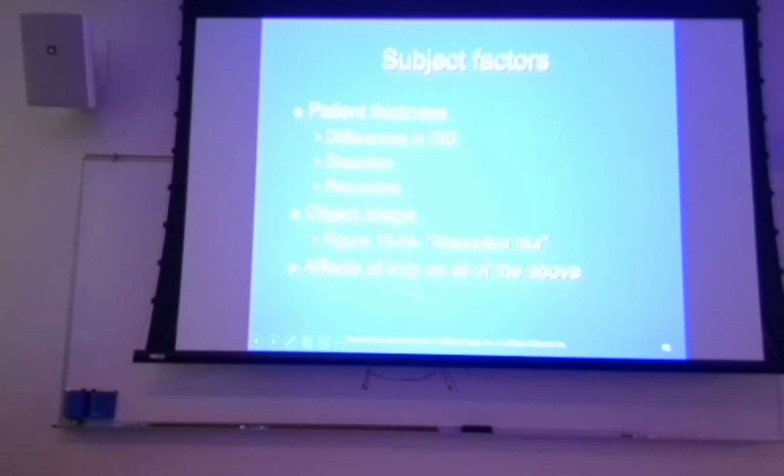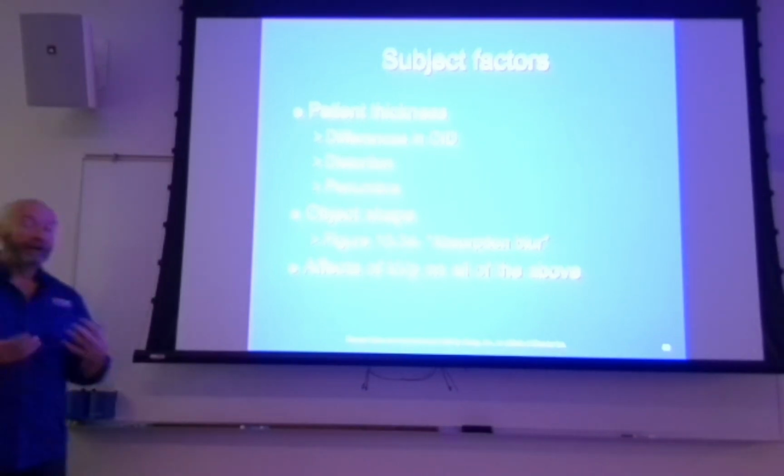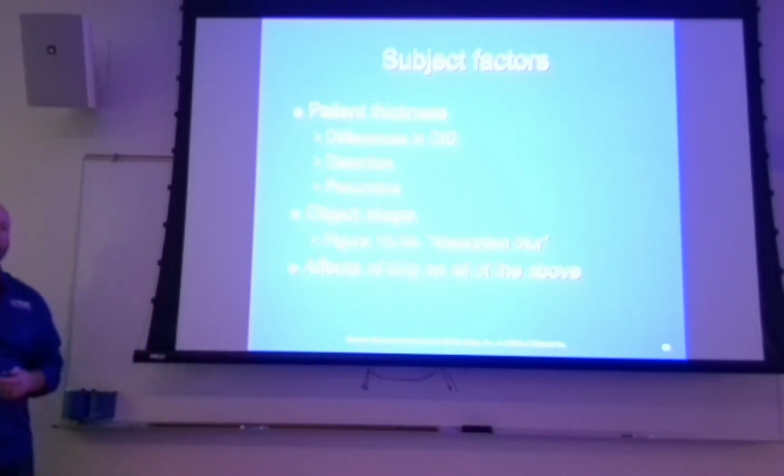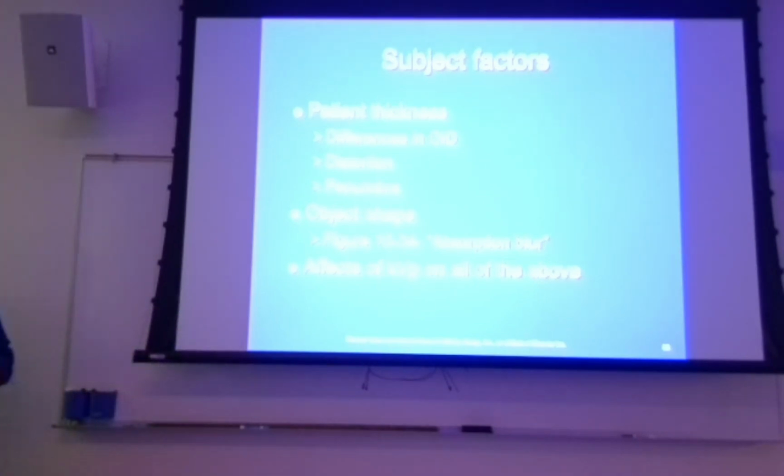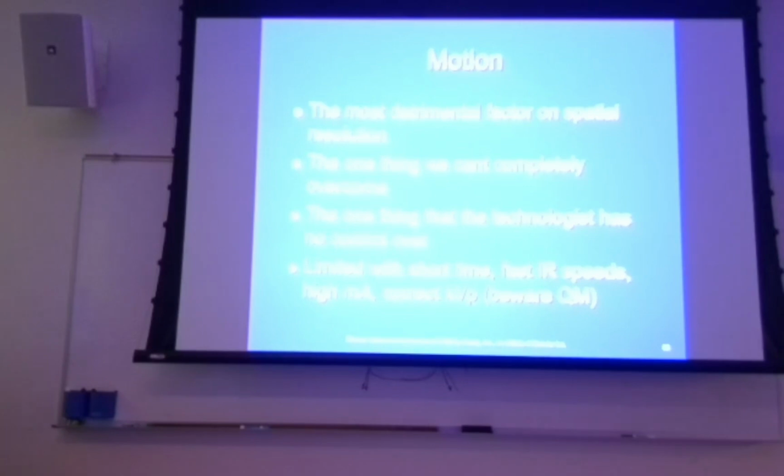We're not really going to have a change in distortion with the change in kVp. You might have a difference in absorption blur and the appearance of loss of sharpness of recorded detail because of the increased penetration in the periphery of something. But that's really a visibility of recorded detail rather than an actual sharpness thing.